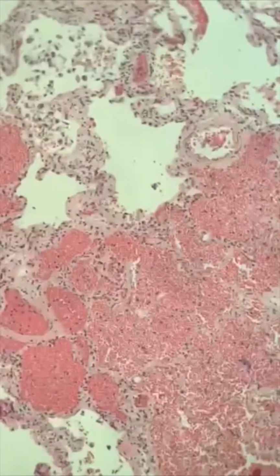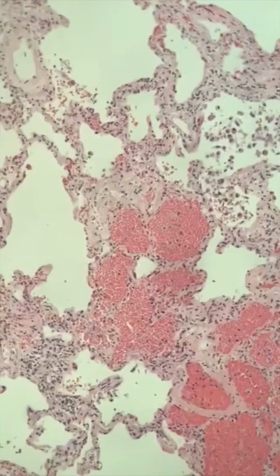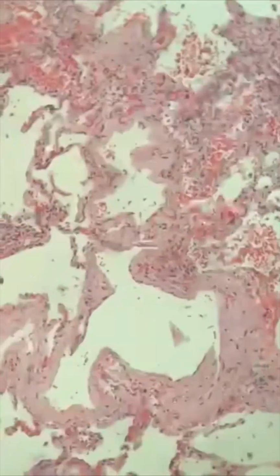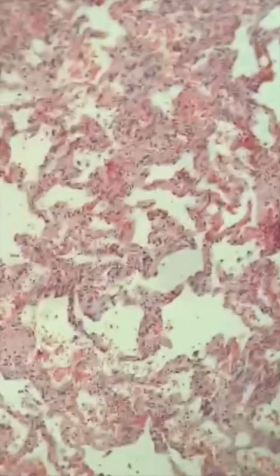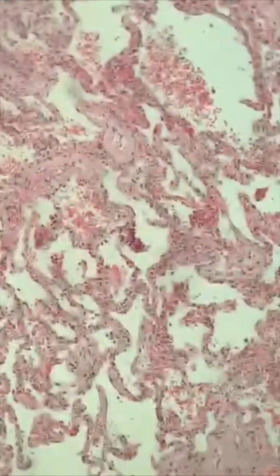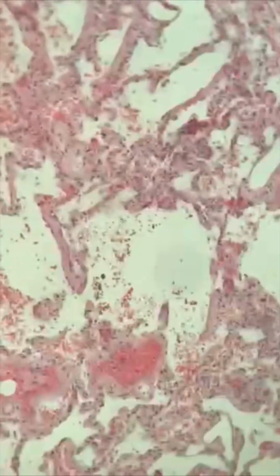But let me just continue to peruse around because you can see the evidence of hemorrhage here. But I want to show another slide. Here's another slide of lung tissue. You can see that there is extensive hemorrhage. And I believe this hemorrhage may have been coming from the tracheotomy site. And there was evidence of both recent and remote hemorrhage. And I'll tell you, this is all recent, evidence of recent acute hemorrhage.